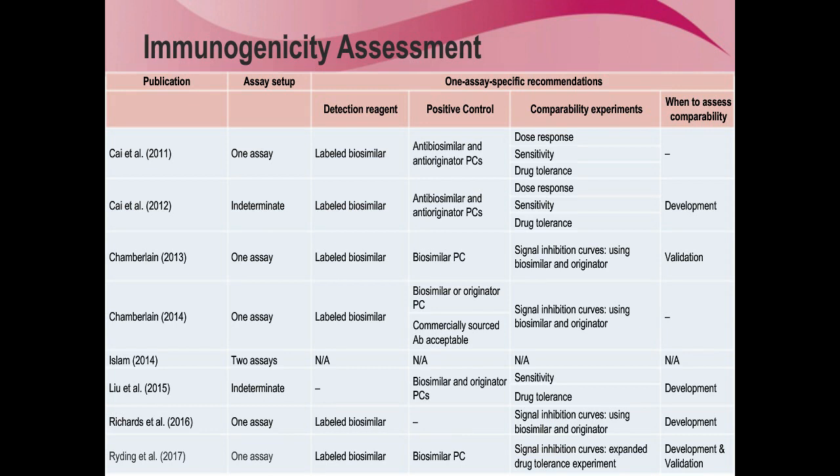Thank you. So in the second part of the talk, I want to talk about the slightly more messy issue, not about the PK profiles, but about working with the immunogenicity of your product. And there's sadly much less consensus on what experiments should be done to show that assays are detecting the immunogenicity of the biosimilar and the innovator in a comparable fashion.